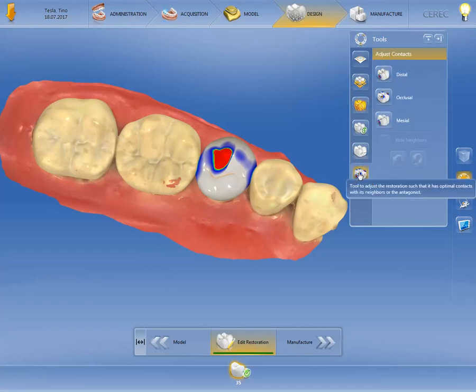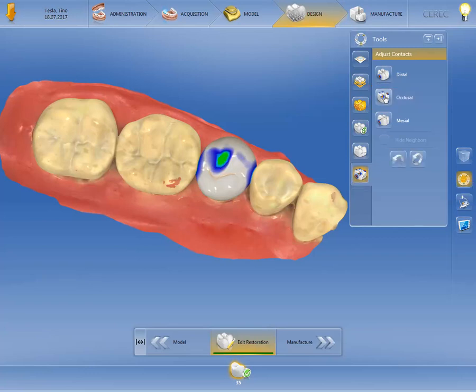Click on the Occlusal option and the CEREC software adjusts the area of strong penetration based on the occlusal restoration parameters defined before. More information on the topic of restoration parameters is provided in the Parameters video tutorial, parts 1 and 2.